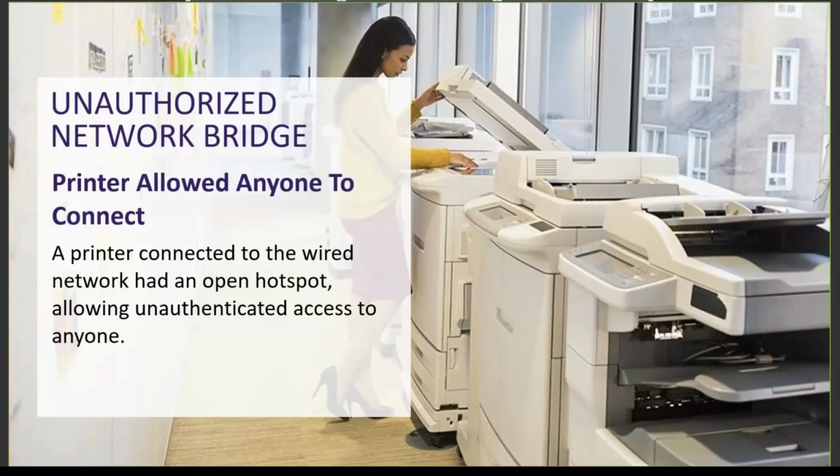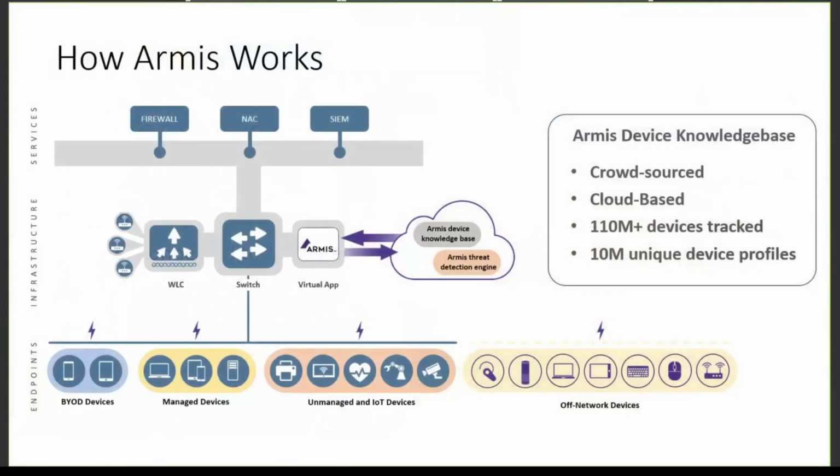Folks can also break into these printers and access the memory on these printers, which stores data around documents that have been printed, scanned, etc. So this is an example of an IT device that would exist in a healthcare environment. And that's the reason why looking at the problem and the picture holistically is incredibly important. An attack can start at one of these devices, spread into the healthcare environment, and in many cases what we see with the likes of WannaCry attacks is they'll start on a more traditional device and start affecting the rest of the landscape, therefore affecting the ability to deliver care and such like that.